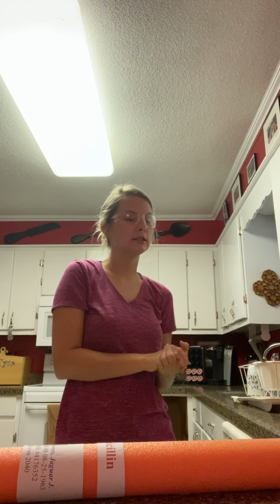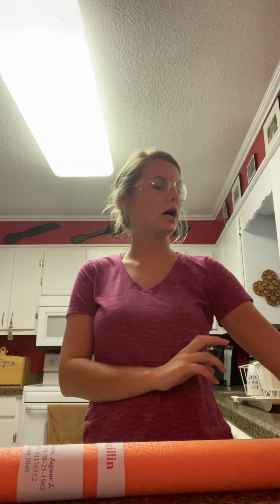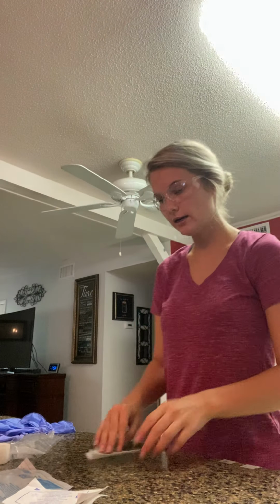I would position the bed to a comfortable working position, lower the side rail, and I would position the patient supine or sitting. And then I will begin opening my packages. I have a sharps container for the sharps, and I will open my packages, continuing to maintain privacy of the patient. I would open the Tegaderm. I don't have a Tegaderm anymore because I use them all, but I would open the package and leave the Tegaderm sitting. I would open the over-the-needle catheter.